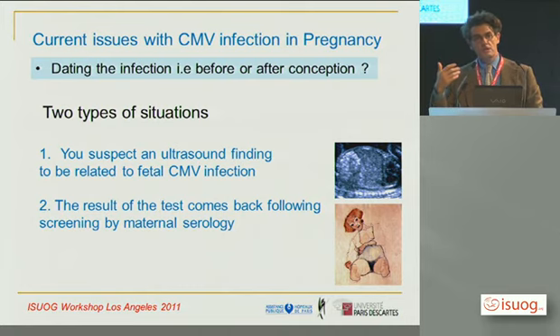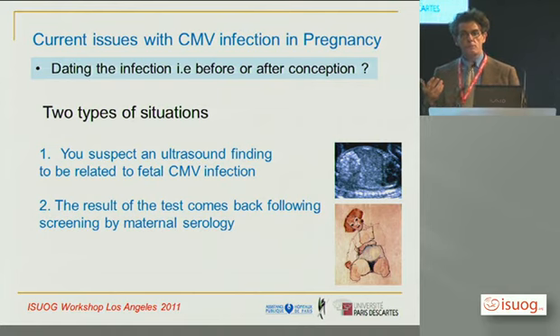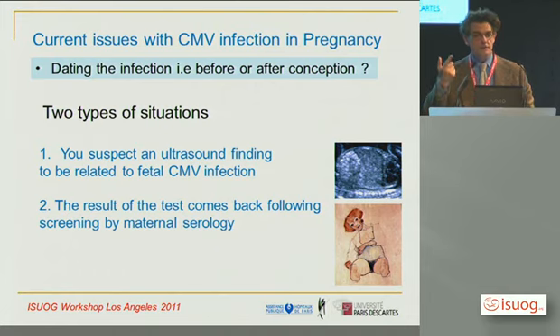The more difficult situation, putting ultrasound in a more unstable position, is when you are following a pregnant woman with serial serologies, or you're just asking for one serology, a one-shot thing, and you see what is compatible with a primary infection, and then you are asking the ultrasound to tell you if the fetus is infected, one, or if the fetus is infected, if the fetus is severely infected. Those situations are very different. The first one is easy, and we will mention a couple of things.